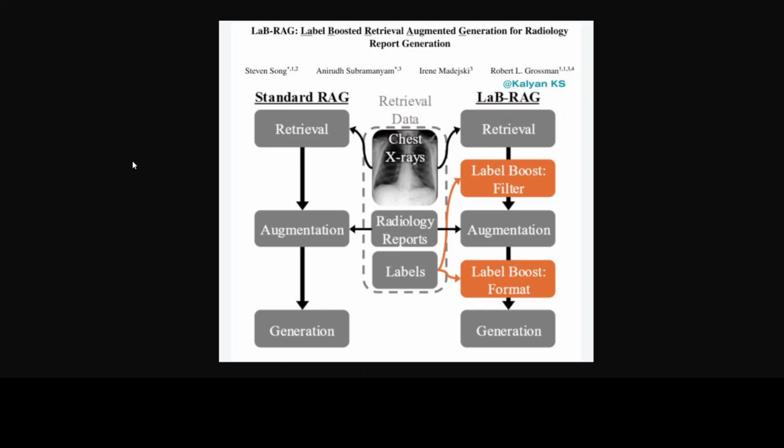If you don't know what retrieval augmented generation is, in very simple words, RAG is a process where you take your own data, such as these radiological documents or images, then you convert that data into numerical representations or embeddings with the help of an embedding model, after chunking it or slicing it into smaller pieces, and then these numerical representations or vectors are stored in a vector store.